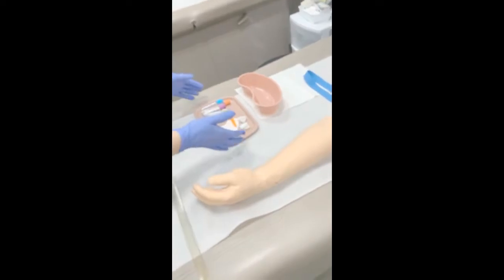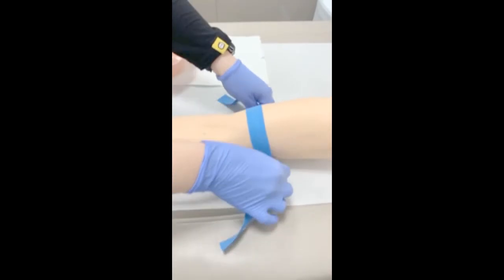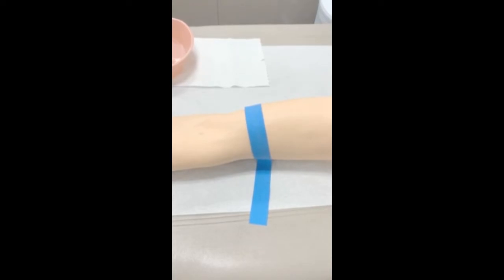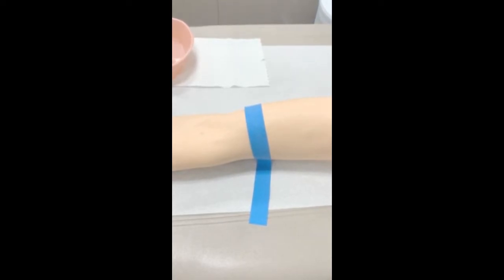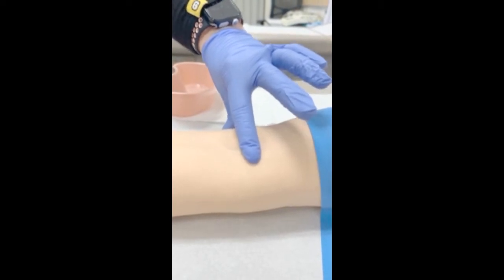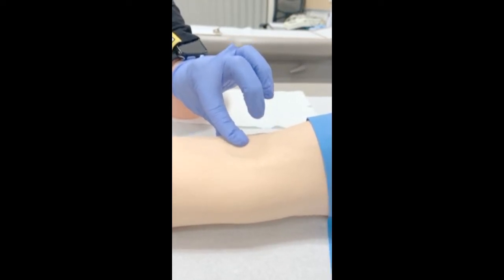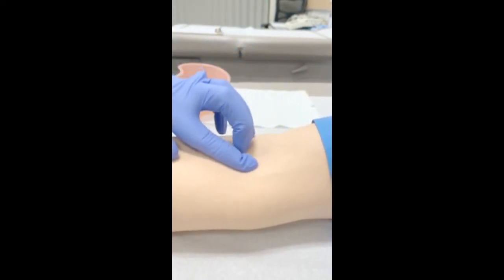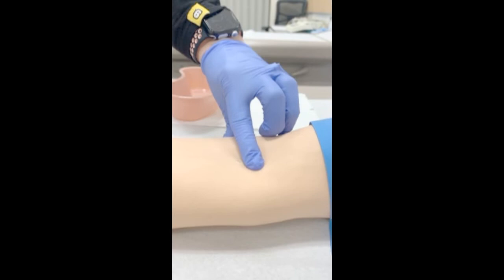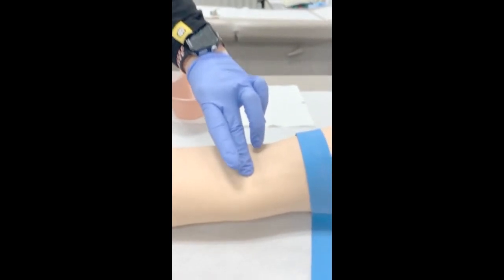First, she's going to check for a vein so we can get the best one. When doing our practical examination, we're setting the tourniquet right at the appropriate spot. Next, we're going to be palpating for the vein — looking for the median cubital right there in the antecubital fossa. If we don't find a good vein there, we'll move laterally to the cephalic. At worst case scenario, we can move medially to the basilic, but our favorite spot is that median cubital vein dead center of the arm. This one feels really good right here.